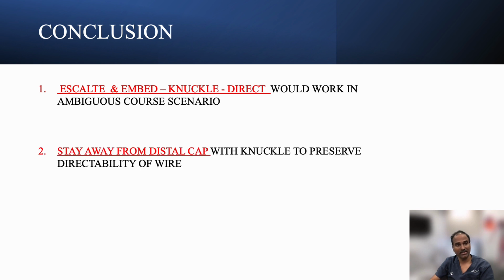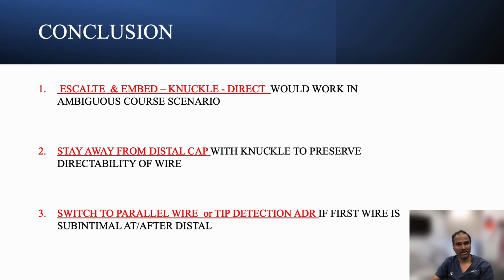Stay away from the distal cap when knuckling is used, to preserve directability of your next wire. Switch to a parallel wire or tip detection ADR if the first wire is subintimal at the distal cap.